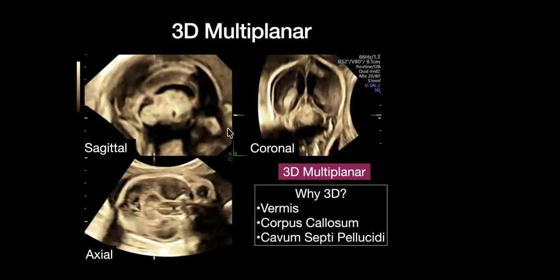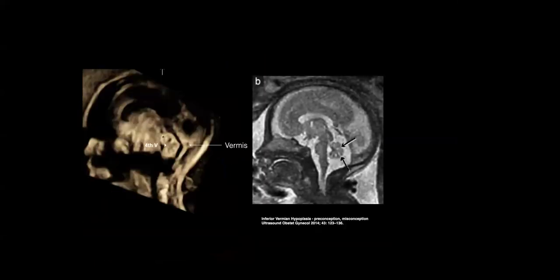Hard to see the face because of baby, depending on what it's laying on, but when you align these structures to where they're in complete alignment, you could appreciate the cavum, the corpus callosum, that beautiful vermis that you could see here. And this allows you to see these mid-sagittal view structures such as the vermis, the corpus callosum, and again, the cavum septi pellucidum, especially if you're suspecting an abnormality. The vermis, I always love to say it's a cute structure because it is.